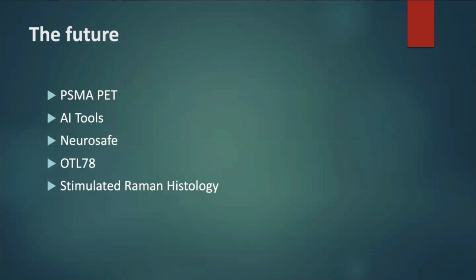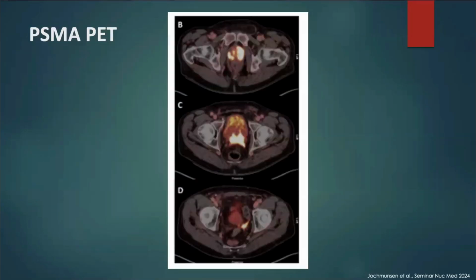So now I'm going to talk a bit about future techniques and other interesting things. Again, I'll focus mostly on PSMA PET, as I think this is probably the most relevant area at the moment. It was difficult to find any good data about the proportion of patients that have PSMA PET imaging as part of primary staging in Canada, but I'd say anecdotally it's a low single-digit percentage of private payers. Again, anecdotally speaking, it's slightly higher in the UK for primary staging, but it's taken off in a relatively big way in Australia as a result of the proPSMA trial.